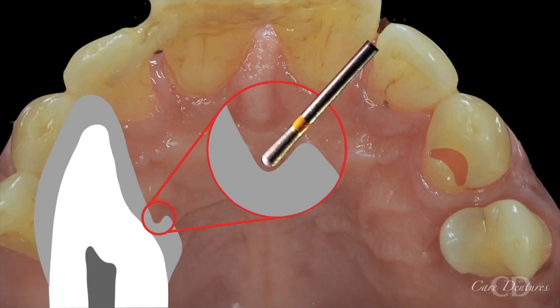An intraoral photograph shows the extent of the rest seat on a canine spanning on the palatal surface like a crescent. Look at the extent, with the edges narrowing out gradually as we move away from the center.